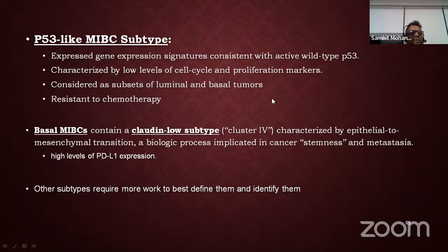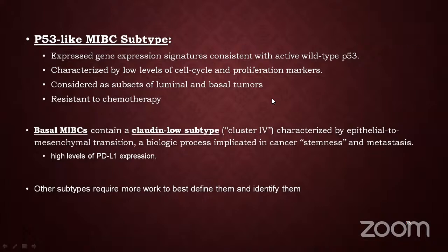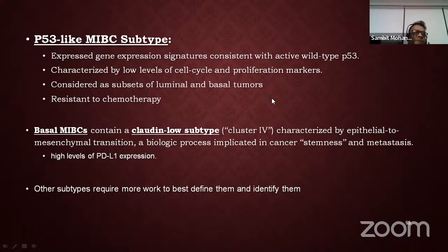You have a clinical history? Is there a clinical history of mucinous carcinoma in the colorectum? IHC will not be helpful. IHC is going to be the same for both. Yeah.